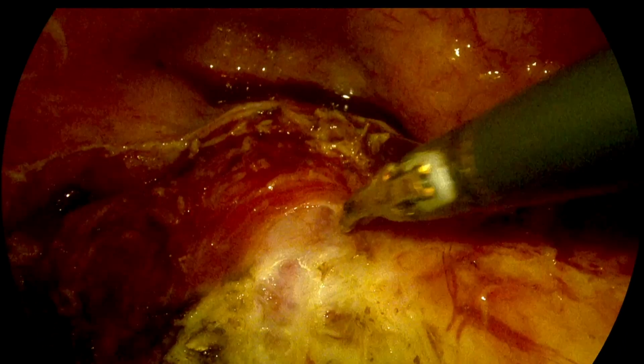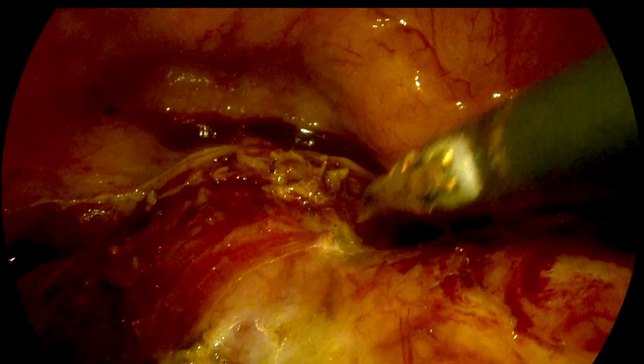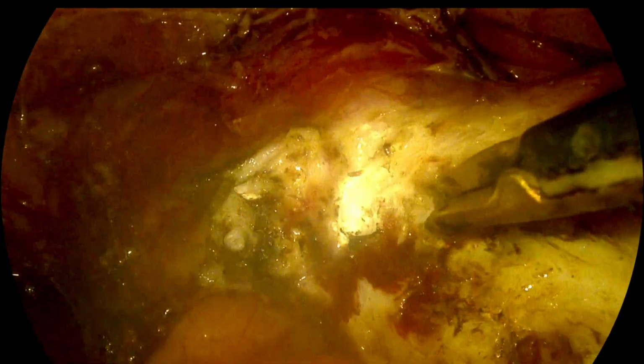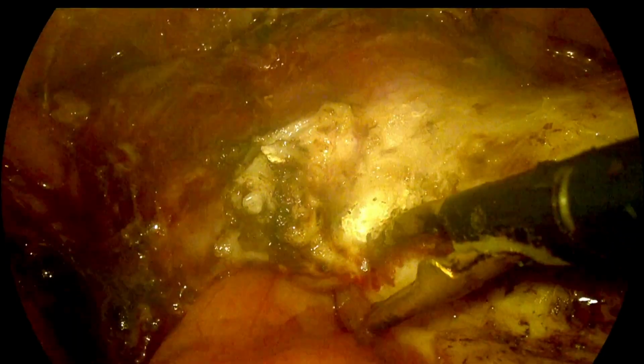So now we are coming near the cervix. The uterine vessel is divided, the isthmus is separated, and the anterior fold of the bladder is also separated from the cervix. The base of the bladder is being separated from the cervix.